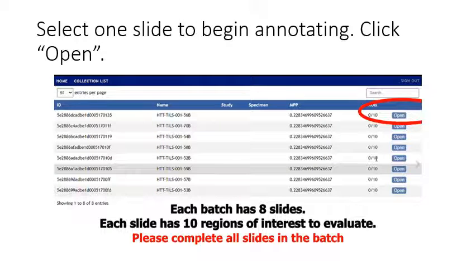Once you select a batch, you will see a work list screen. Click open to select an image to begin annotating.